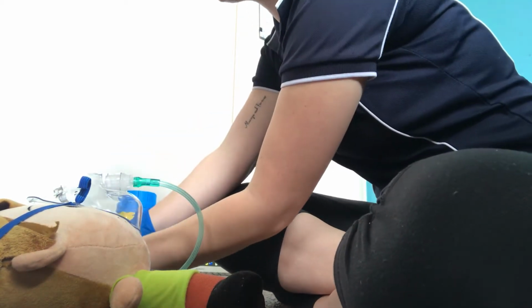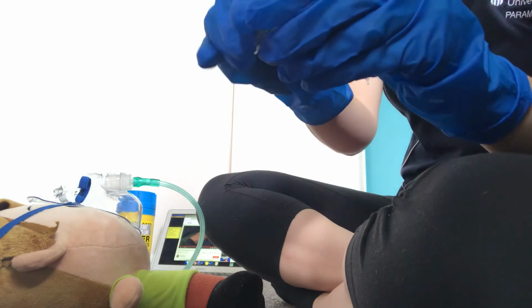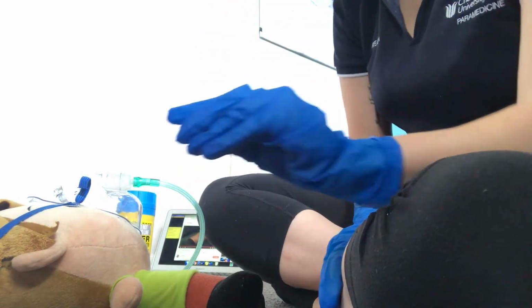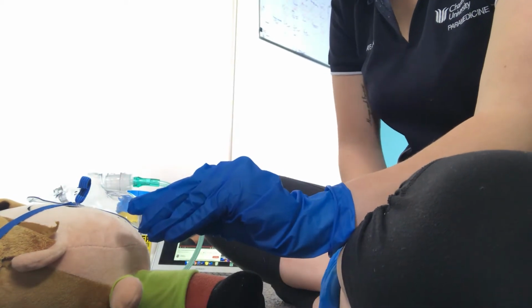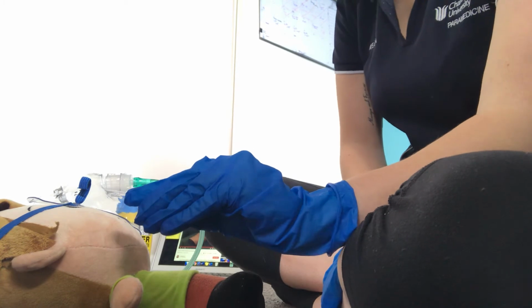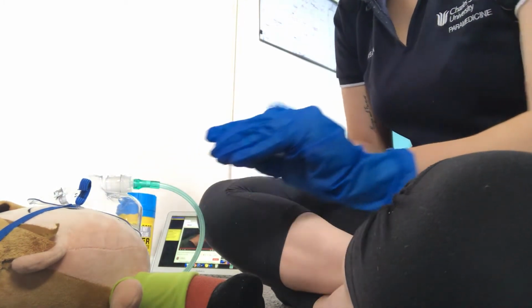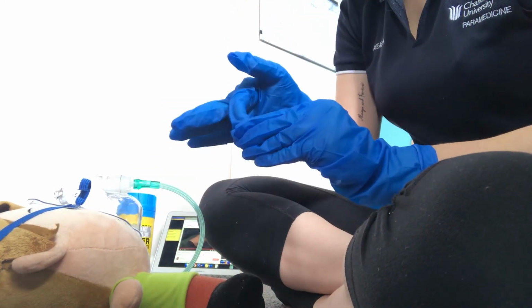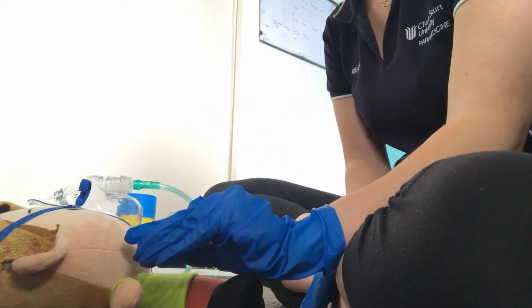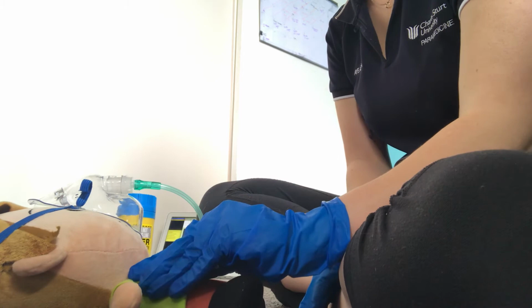We're going to remove the needle using aseptic technique, and we're going to insert it at the site that we have just found. So it's at the second intercostal space at the midclavicular line, and we're going to insert the needle at a 90-degree angle and just above the third rib. So we're going to go in, 90-degree angle, straight down.